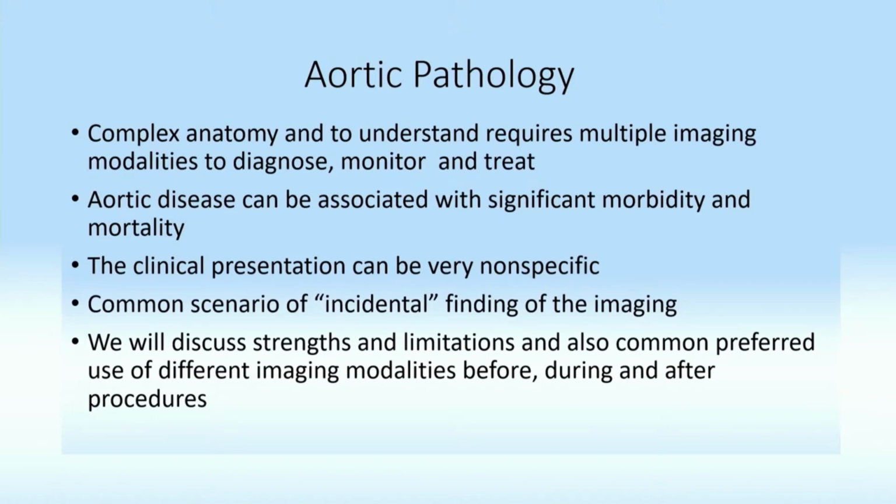The aortic pathology is a very complex anatomy, as you could see, and understanding it requires multiple imaging modalities to really know what we are looking at. This is how we diagnose, this is how we monitor, and also we use it during the treatment. Those TAVR procedures never happen without echocardiography.